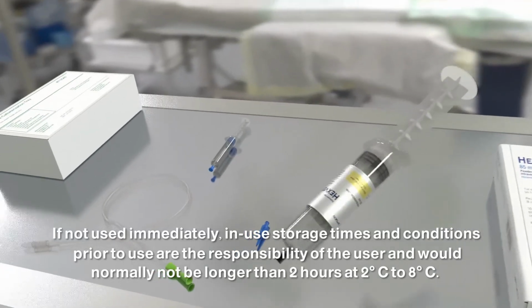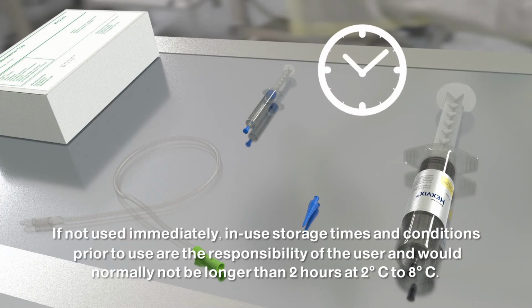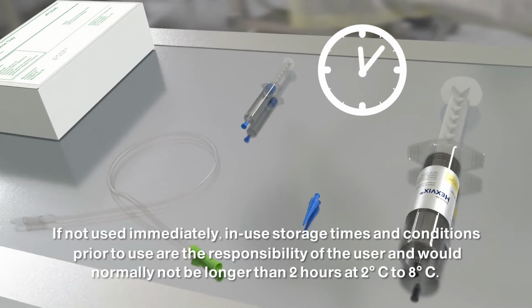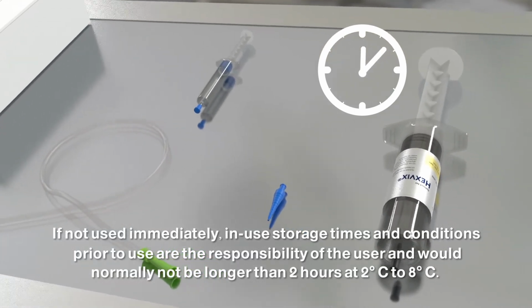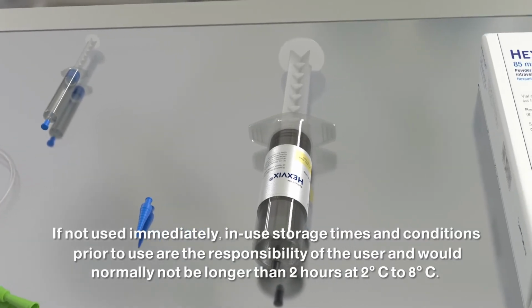The appearance of the reconstituted solution is clear to slightly opalescent and colourless to pale yellow. Add 2 hours to the time of reconstitution to determine the expiration time. Write the expiration date and time on the syringe label.